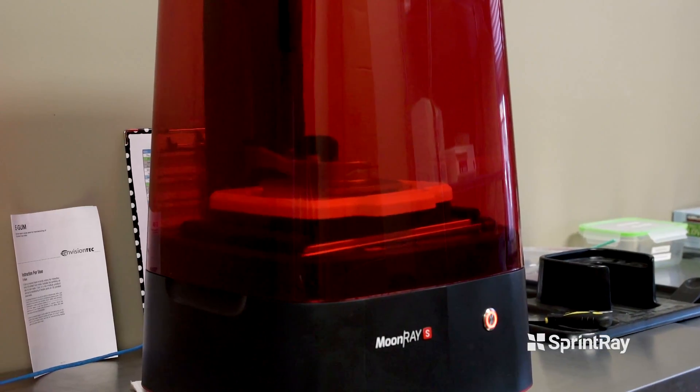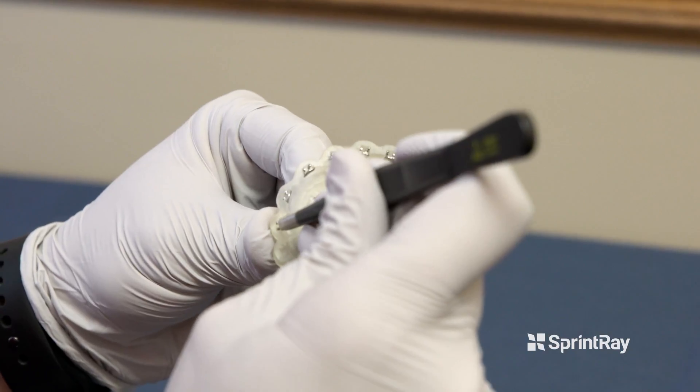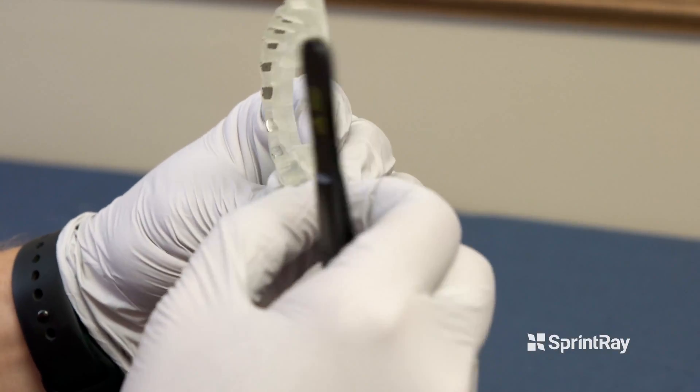We have experimented with other printers from other companies with varying degrees of success, but in terms of price point, it's difficult to beat what you can get with the Moonray. For the everyday orthodontist looking to buy their own printer, I can't really think of another brand that for the price point is going to give you that good of a printer with that kind of precision.